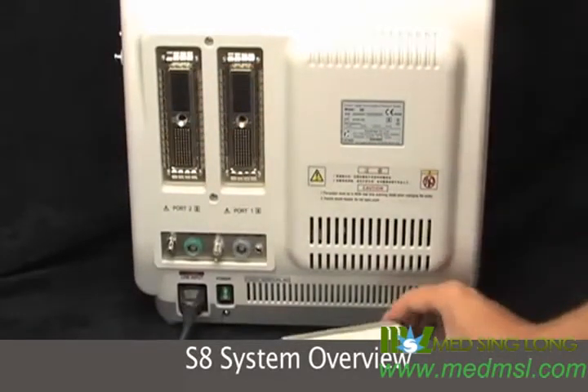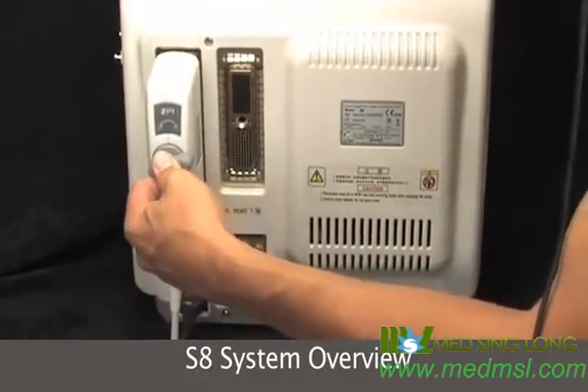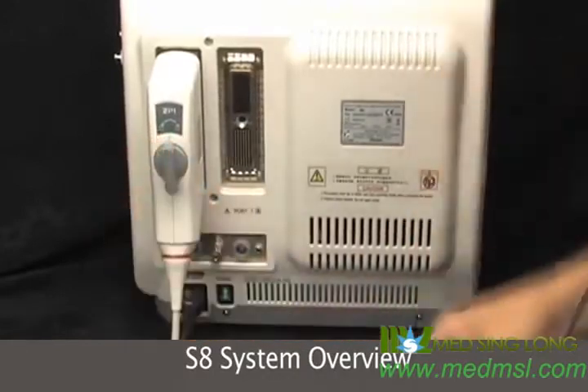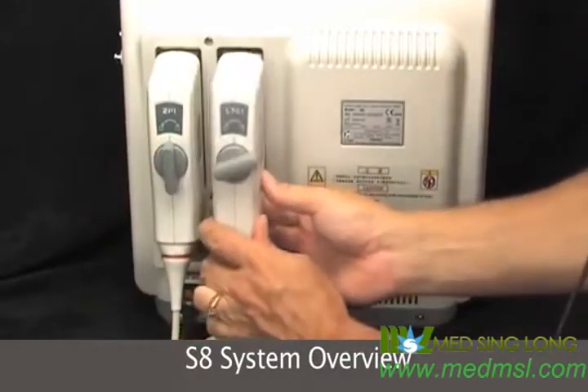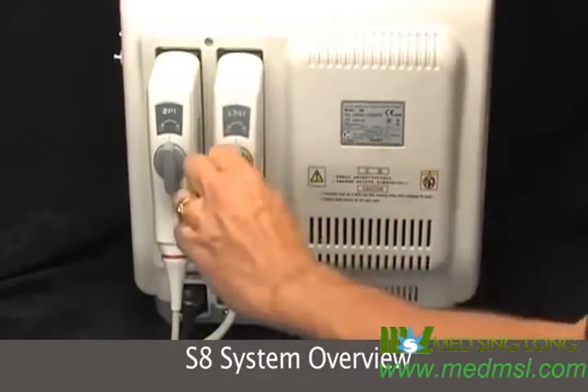So inserting the transducers — you hold it by the switch, push and twist. Set it in, hold it by the switch, push and twist. Very simply.